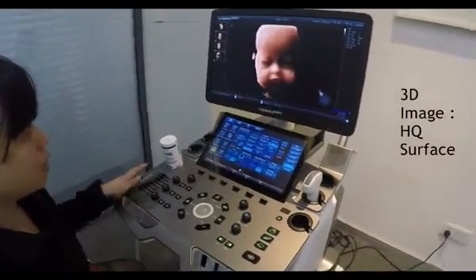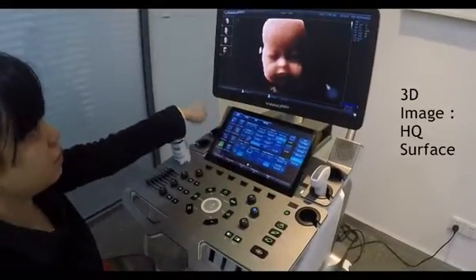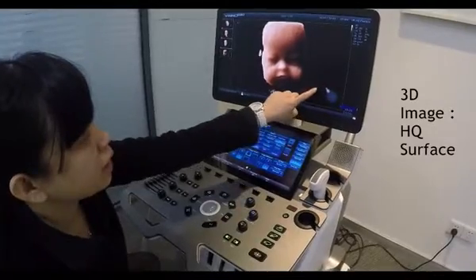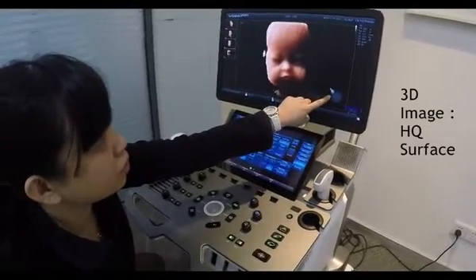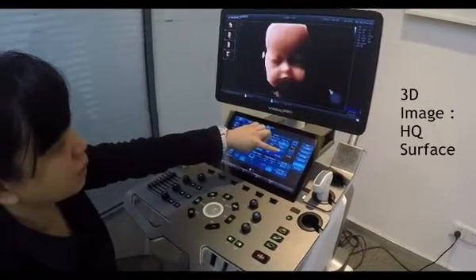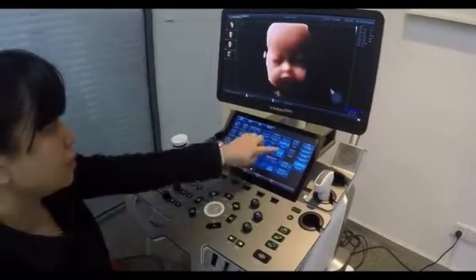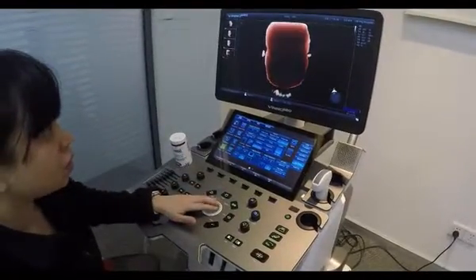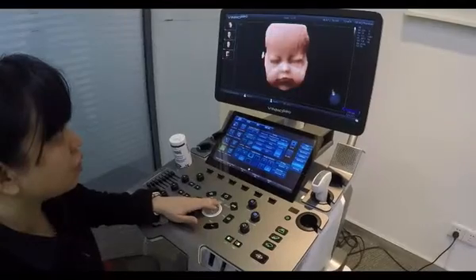So now this is the high quality imaging. We can see there is a light bulb here, so we can adjust the projection of this light by turning on the HQ light button on the touch screen. After I activate the HQ light, I can just move the trackball to control the direction of the light.